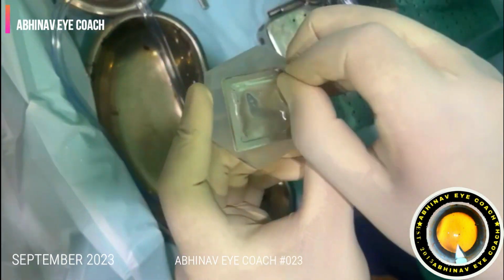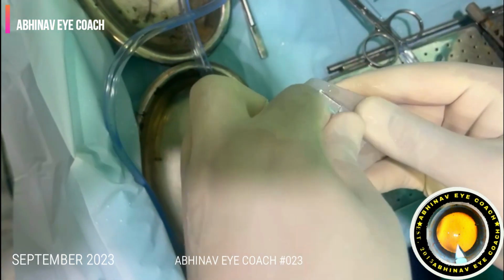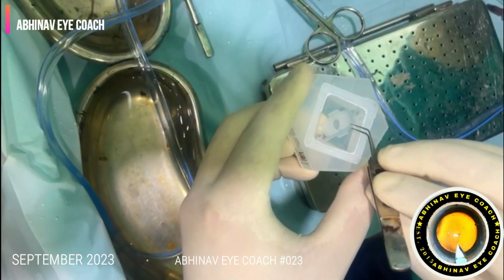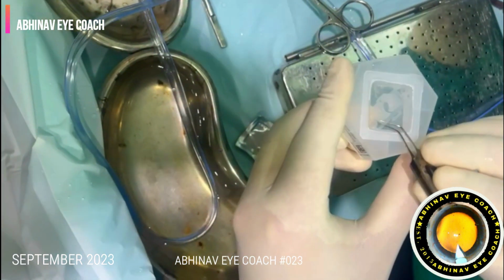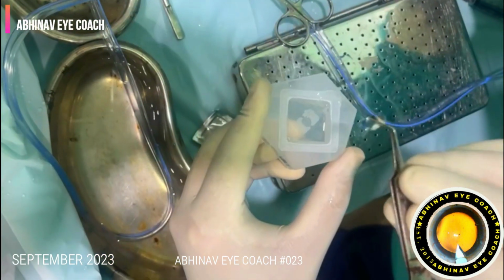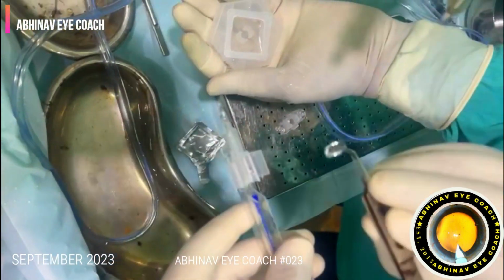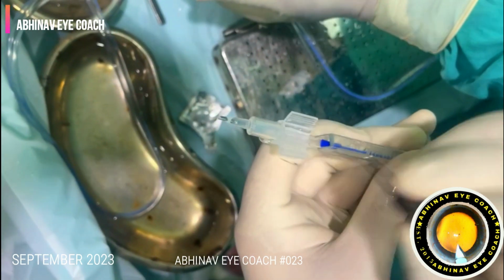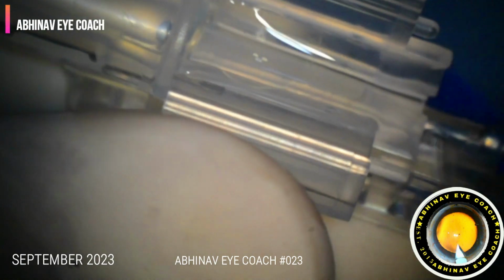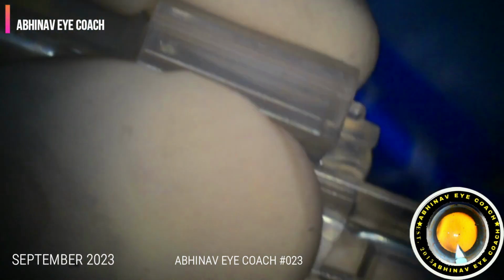So this is the packing and the blister pack. The Lucidis IOL comes in this blister pack and a plastic plate is kept on the IOL. So first we remove this plastic plate and keep it sideways. Now this is the IOL which is beneath this plate, and the IOL is placed straight into the cartridge. The cartridge is closed and a click or snap is heard.